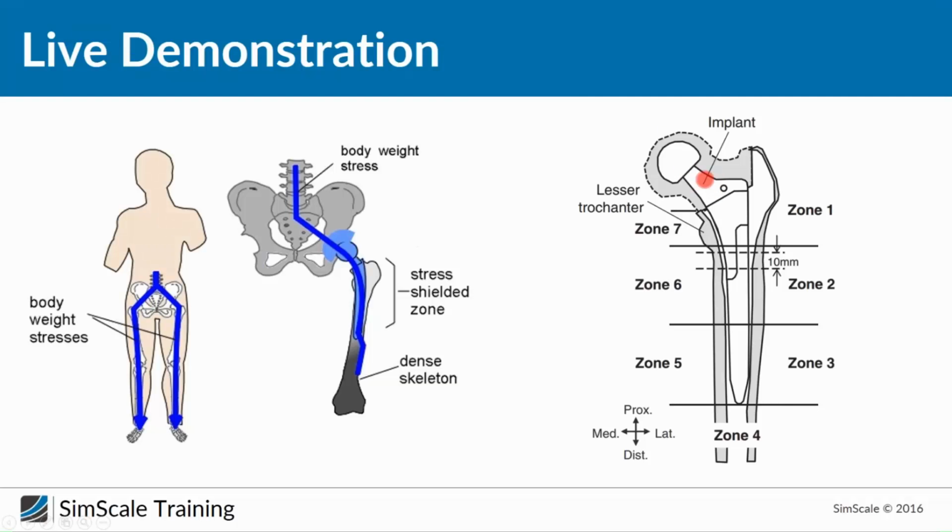So you have an implant, which is going into the femur bone. On this implant, you have a new artificial head. And both of these things are going inside the bone. And so you are replacing this biological joint by this mechanical joint.